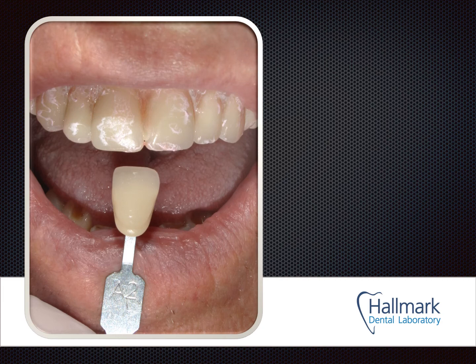A shade tab photograph — in this case the patient has chosen an A2, and that discussion happened before this stage, so sending this photo isn't strictly necessary. However, it's a good habit for any case requiring lab communication to take a shade tab photo. The shade tab and teeth are nicely square-on, and the tab information is clearly visible. On the downside, some denture adhesive is visible that should have been cleaned up, and there's a bit too much flash reflection to be highly valuable as a shade tab photo.